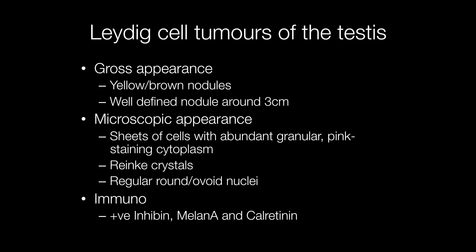Histologically there are sheets of tumour cells with abundant granular pink staining cytoplasm, regular round to ovoid nuclei, and there are crystals called Reinke crystals or crystalloids. As with other sex cord stromal tumours, useful immunostains include inhibin, melan A, and calretinin.